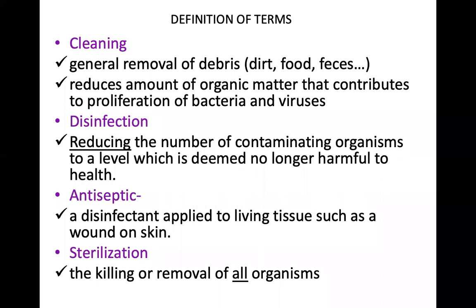if it is a research setting, you're dealing with anthrax, okay, compared to a routine diagnostic lab where you're trying to decontaminate a laboratory surface after you have carried out processes with vegetative bacteria like E. coli, Proteus, etc. The kind of disinfectant chemicals that you're going to pick to carry out your disinfection will be guided by the intrinsic resistance of that microorganism. Okay, and I'm going to show you a slide on that.